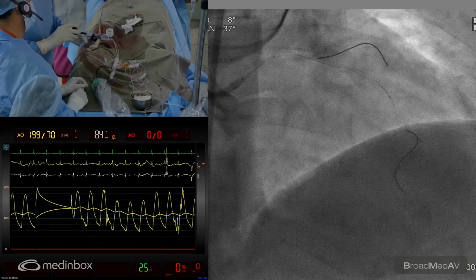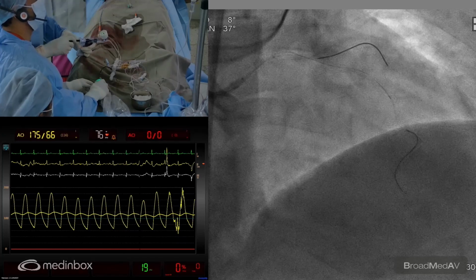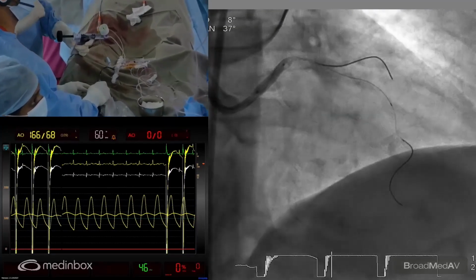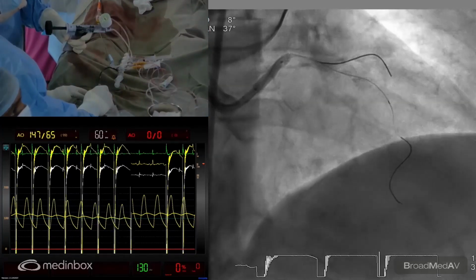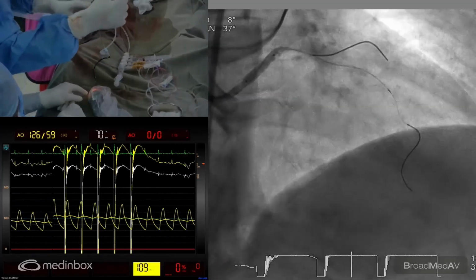Okay, so I'm going to go up full again, so we'll give the entire 10 cycle this time again. So we are at 4 now. Okay, go ahead. Starting on 1, 2, 3. And the shockwave pulses are not capturing the heart. We can see clearly there is a dissociation between the shockwave pulses and the arterial pressure tracings. Deflate, sir.